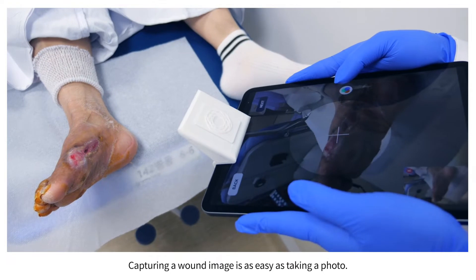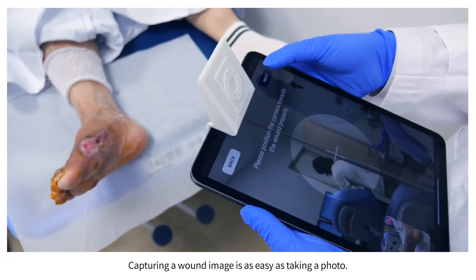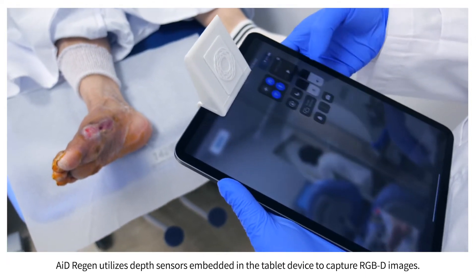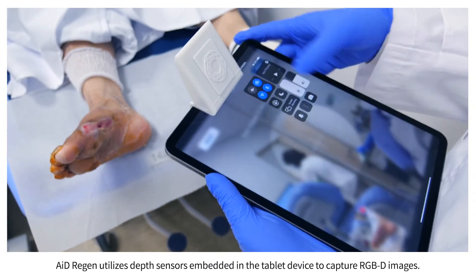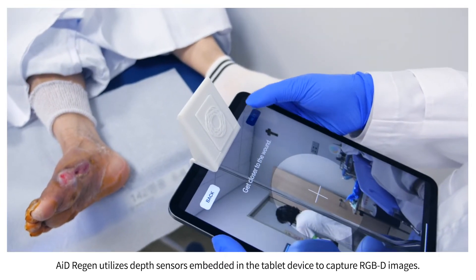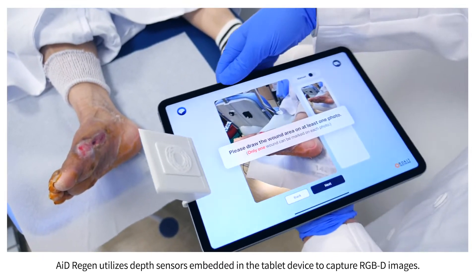Capturing a wound image is as easy as taking a photo. AID Regen utilizes depth sensors embedded in the tablet device to capture RGBD images.